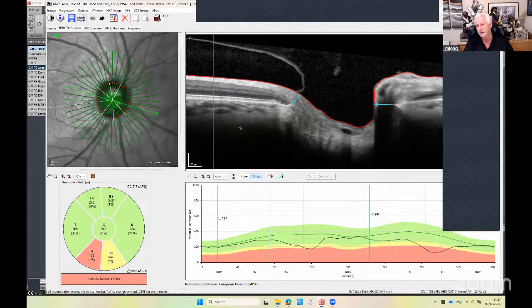And if you think about cup disc ratio, we're looking at vertical cupping, if you like, but there's no anatomic position for the cup. It's actually this thick bundle of superior nerve fibers which is thinning, or this thick inferior bundle of fibers that's thinning, that creates the impression that we have a vertical cup disc ratio change, but it's actually the thinning of the rim.